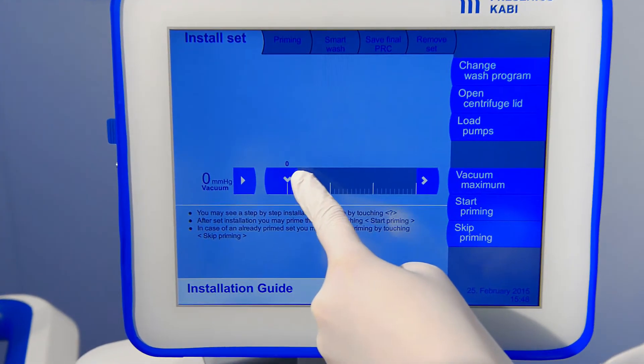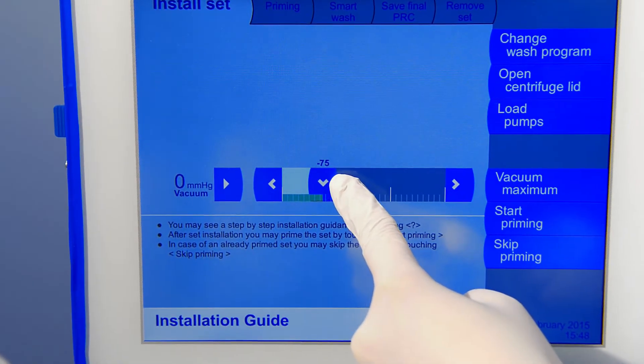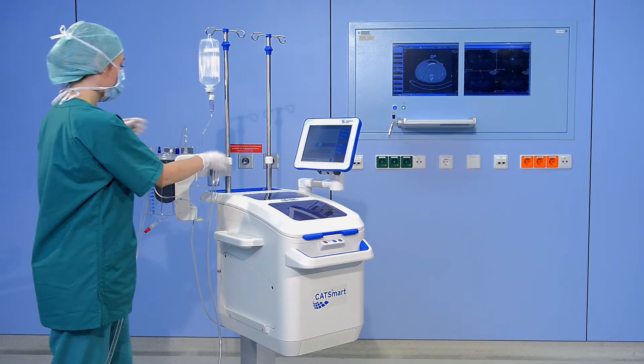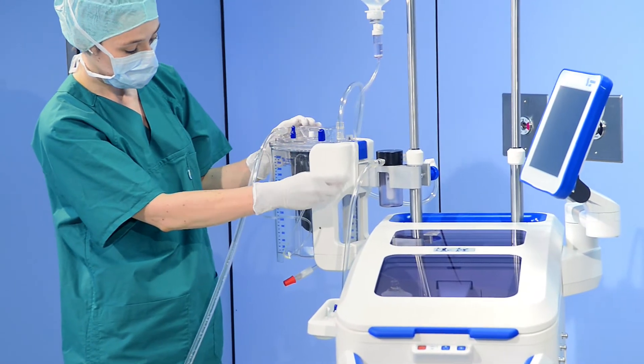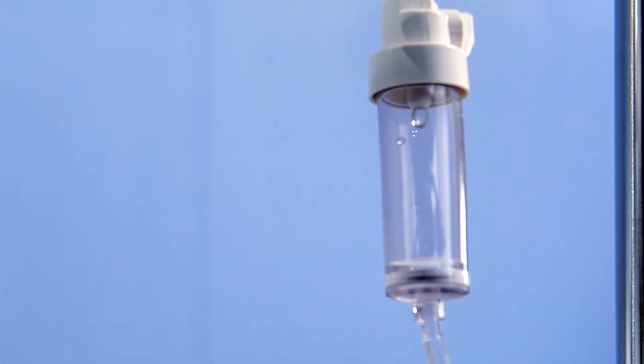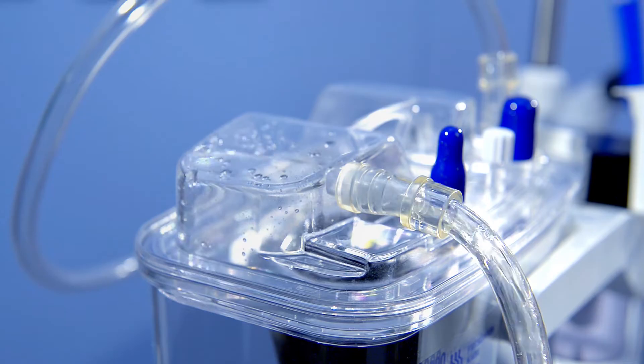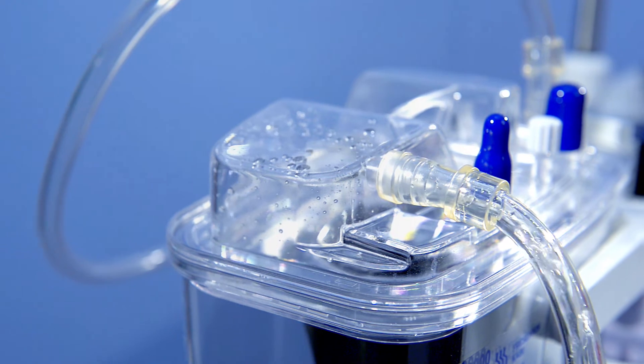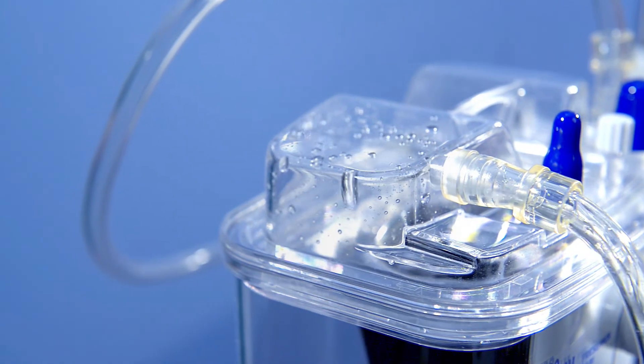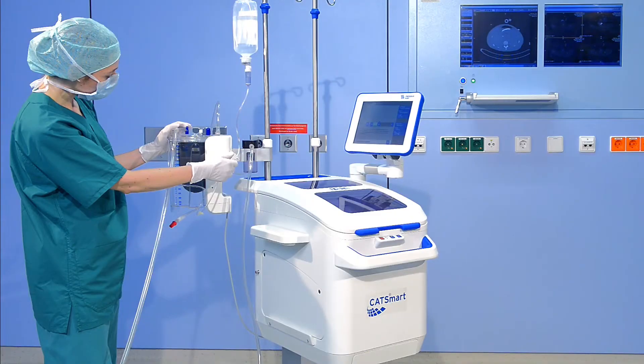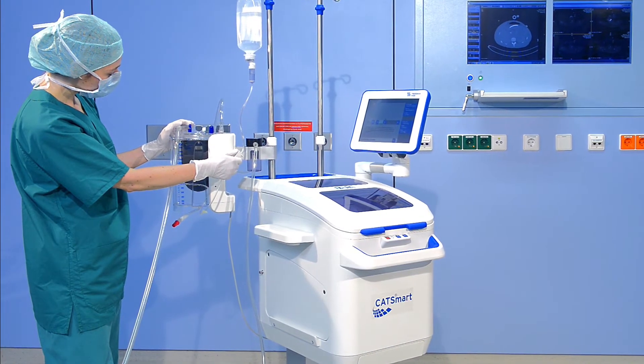Adjust vacuum via the touch screen to minus 100 mm mercury. When suction has begun, open the roller clamp below the drip chamber and prime the suction line and the filter with 250 milliliters of anticoagulant. We recommend heparin. Afterward, adjust the flow to 60 drops per minute.